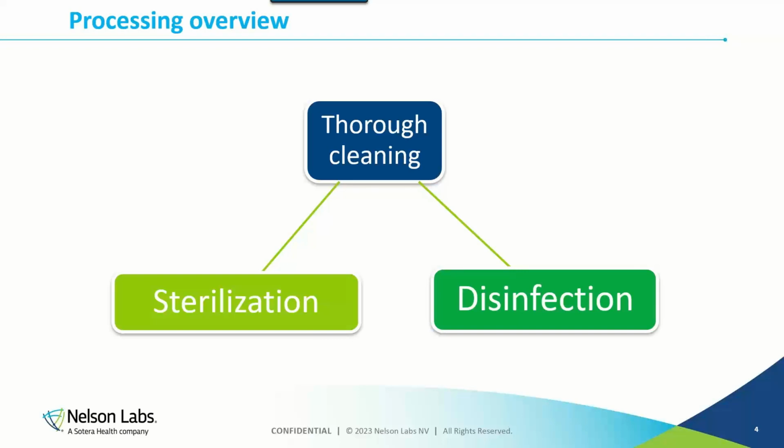And then in our second step, in our disinfection and our sterilization, that is where we are going to kill off our microorganisms. Historically, a little bit more focus has been put on disinfection and sterilization because, of course, microorganisms are what's going to actually cause healthcare-acquired infections. But we now know that if your cleaning is not effective, your disinfection or your sterilization is also not going to be effective. So these are really very important processes to have.